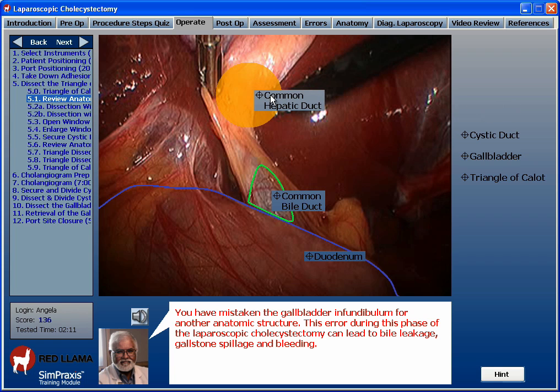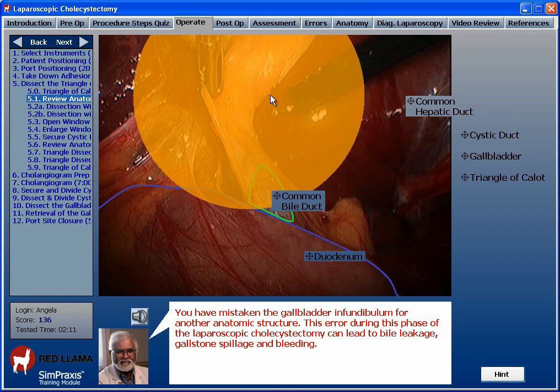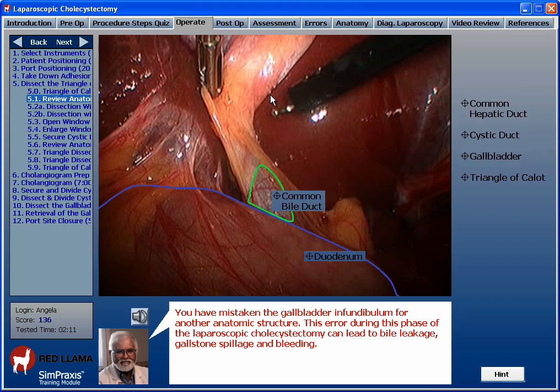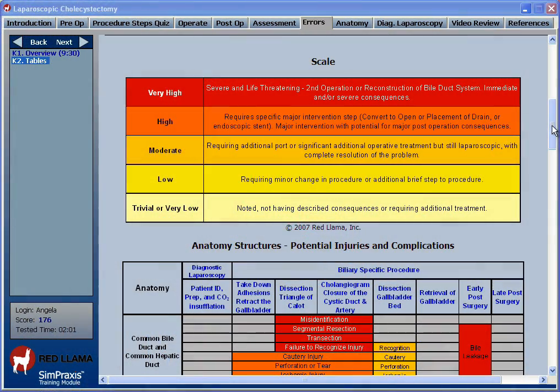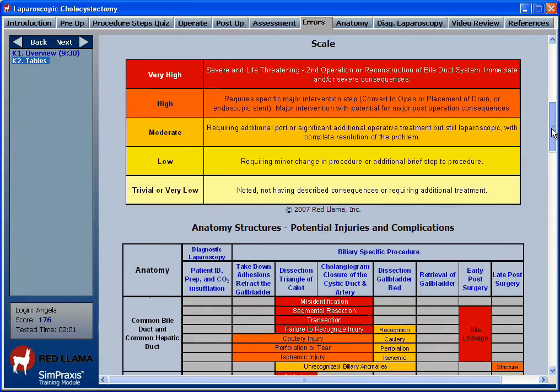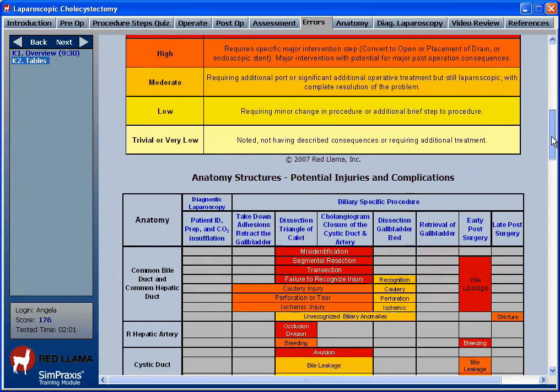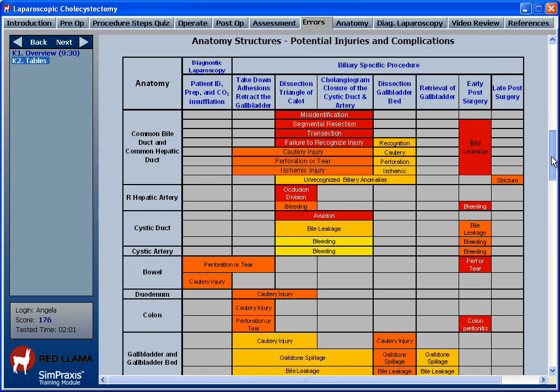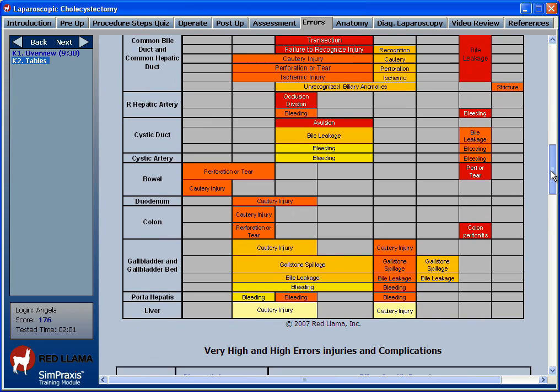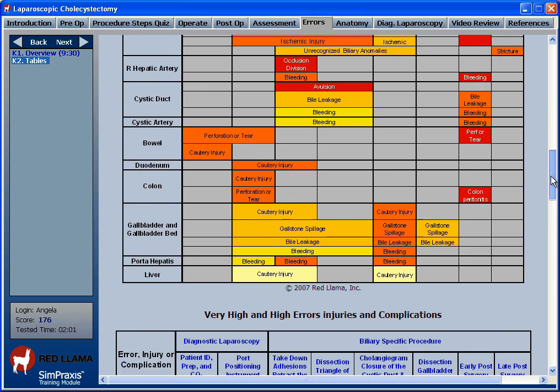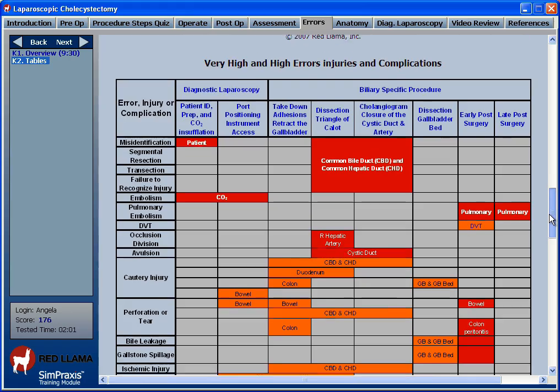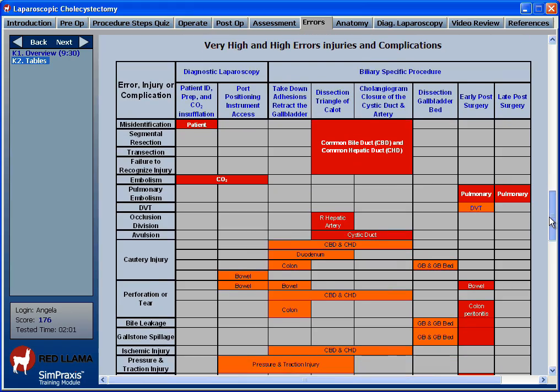You have mistaken the common bile duct for another anatomic structure. A new and unique risk table is developed to enhance and expand the learning process and is customized for each procedure. Each table links potential errors, injuries, and complications to the individual steps of the procedure.